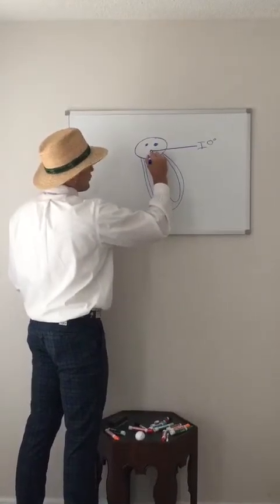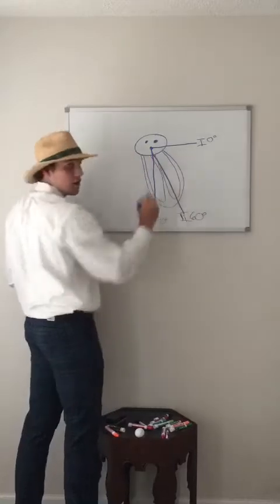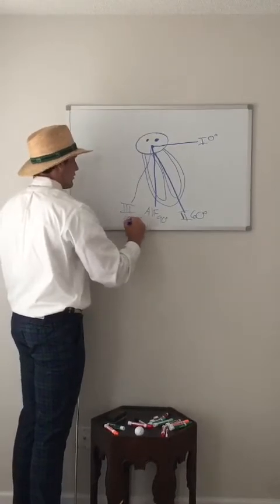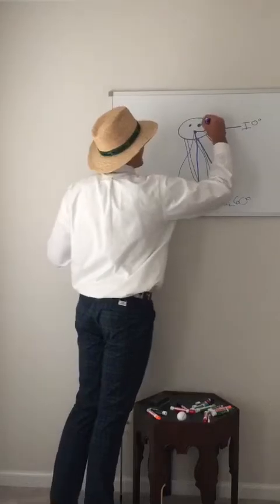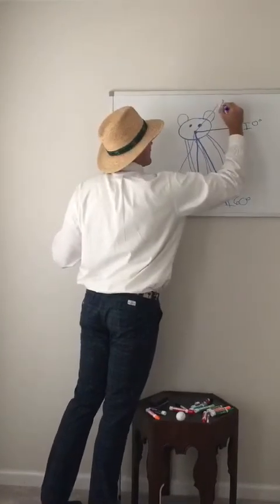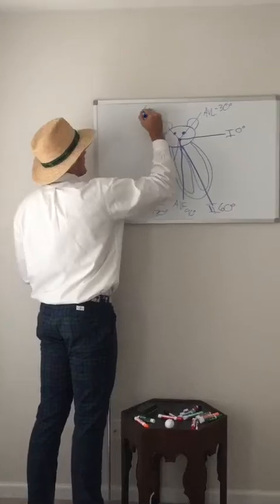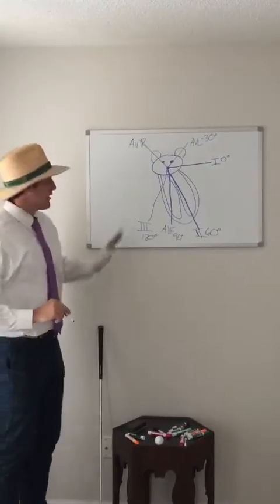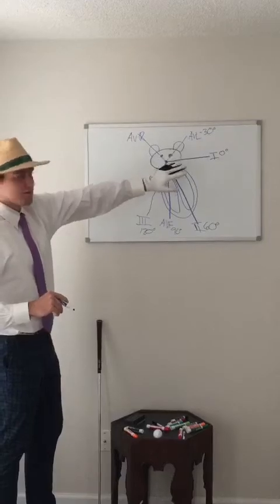The rat is going to have another whisker called lead 2 at 60 degrees. Another whisker over here called lead 3 at 120 degrees. Now, wait a minute. I thought rats had ears. They do. This rat's got 2 ears, a left ear called AVL at minus 30 degrees, and an AVR ear, which we call no man's land. Now, these are 6 of the 12 leads, and I always thought it's very easy to remember by drawing the whiskers and putting on the ears.